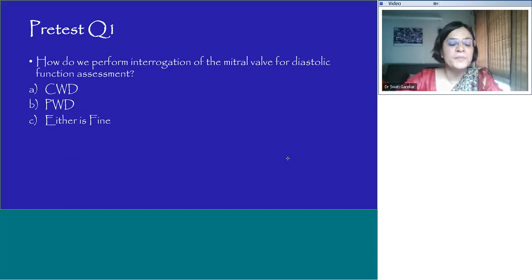So before we begin, my first question for you all, and this is going to be an interactive session, I hope. Please ask questions. My first question is, how do we perform interrogation of the mitral valve for diastolic function assessment? Do you use a continuous wave or a pulse wave Doppler, or either is fine as long as you get a spectral Doppler tracing? Can anyone answer so that I can move on?